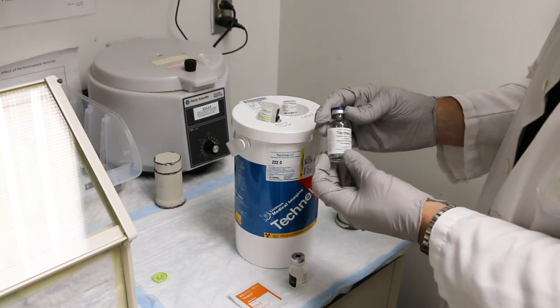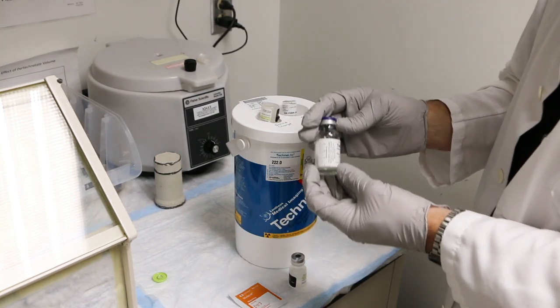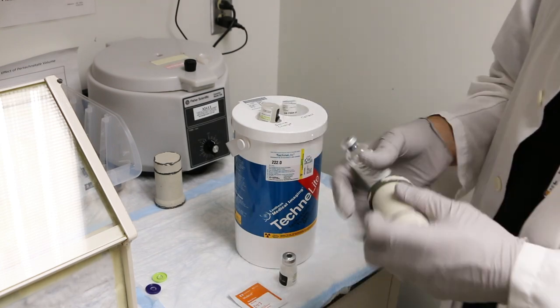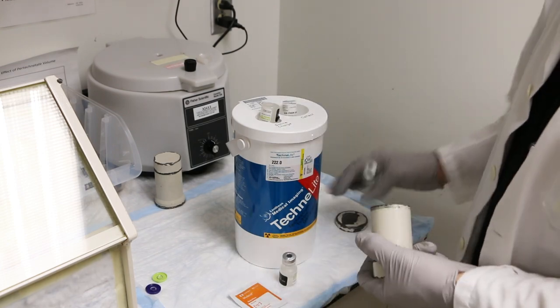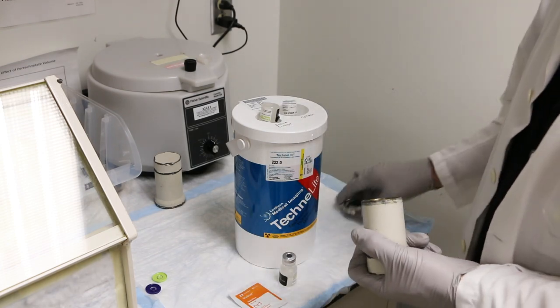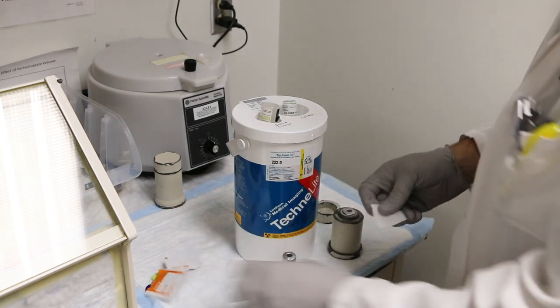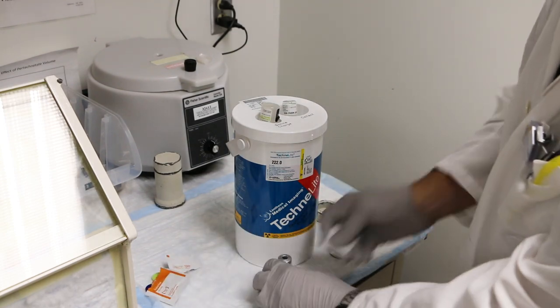The collection vial will have enough vacuum to pull all the saline through the generator. As the collection vial will be radioactive at the end of the elution process, it is placed in a lead shield prior to elution. Swab the tops of the saline and collection vials to ensure they are sterile.